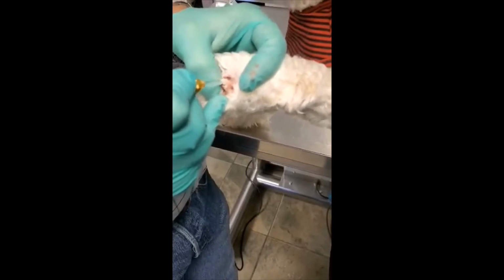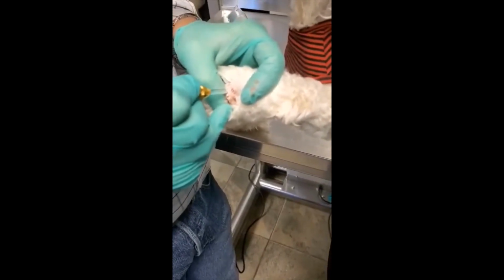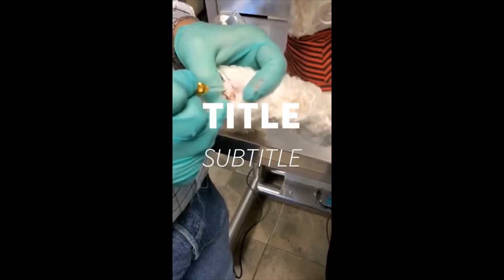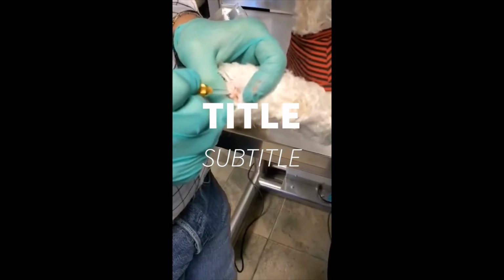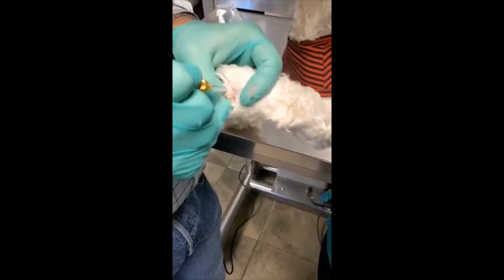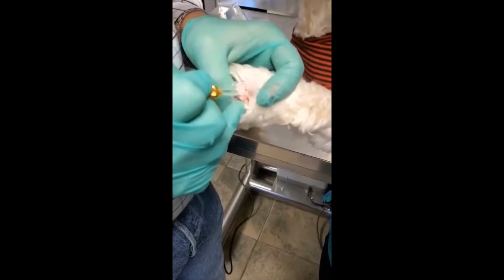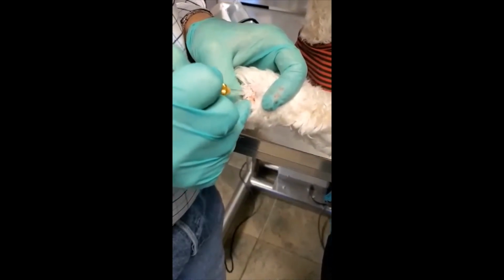This particular distal limb papillomatous mass is both interdigital as well as right at the metacarpophalangeal joint, and these tend to elicit a lot of attention postoperatively from Westie type breeds.